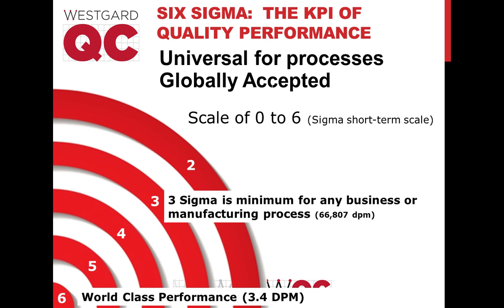That's a great question, and that is a challenge that labs face in chemistry. They can face it in hematology. They can face it just about anywhere. There are no perfect instruments. There's always the possibility you're going to get a bad assay on a big menu. I will say specifically to CO2, that is a challenge of an assay. It's very hard for an automated instrument to get a good CO2 method. And typically what we recommend is sometimes you can look at, if it's an open system, you can see if you get a different reagent and improve the performance.